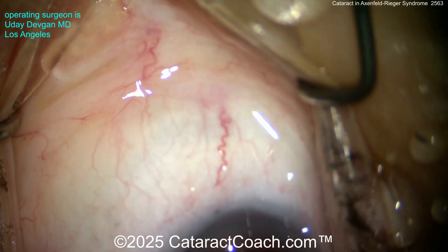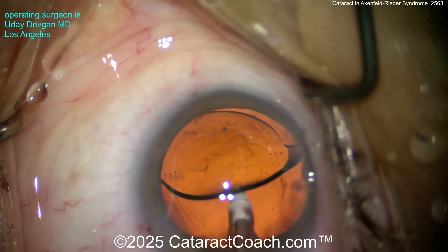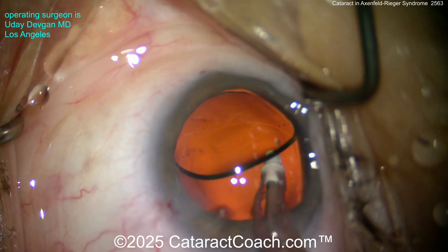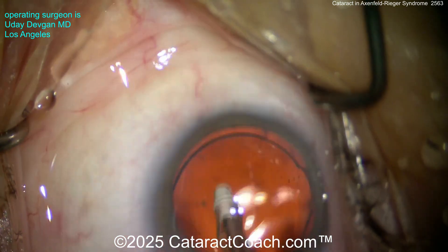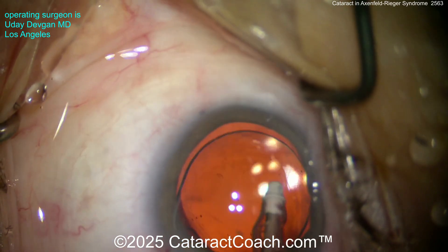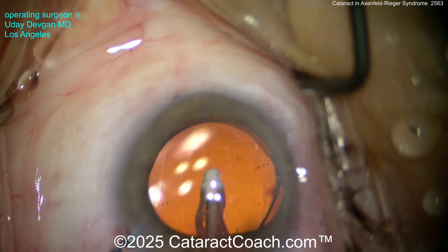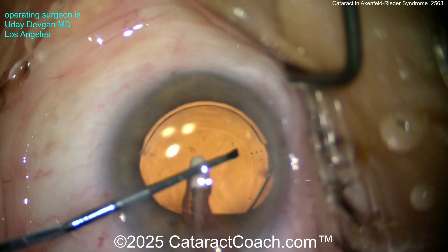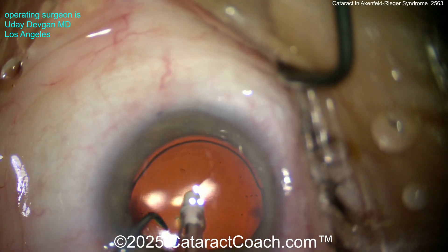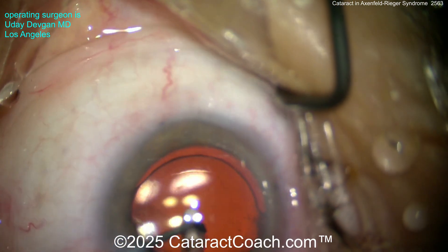Look — beautifully positioned with good 360-degree overlap by the capsulorhexis. Let's remove our viscoelastic. We're very fortunate this patient does not have glaucoma — half the patients with Axenfeld-Rieger do have glaucoma. We're also fortunate this patient had good zonular support and the cataract surgery went beautifully and uneventful. You can see the marks on the cornea — we're going to rotate that lens just a little bit more to get it lined up.